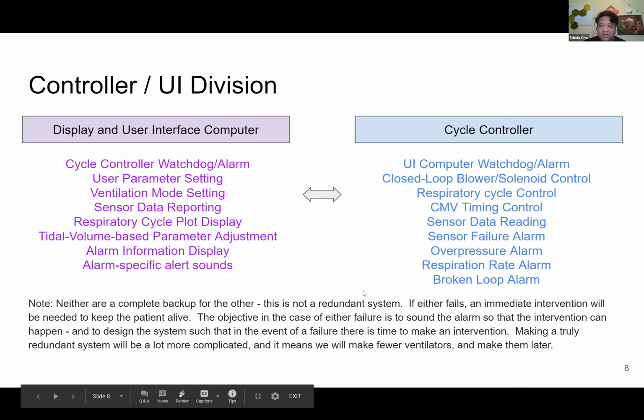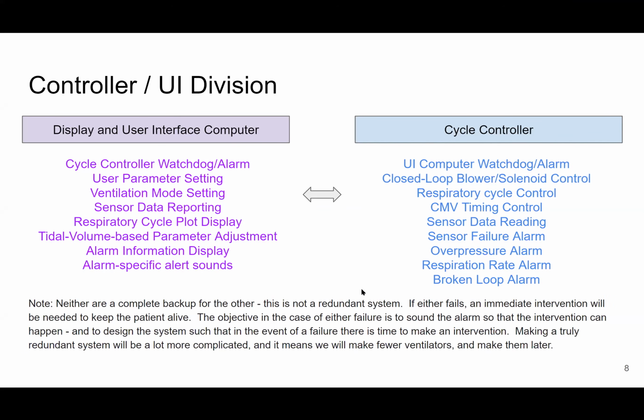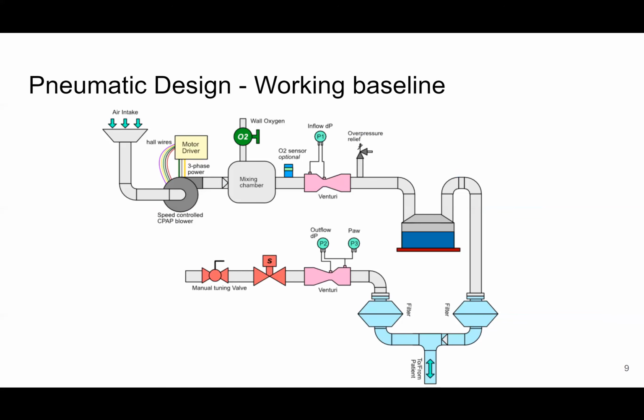Most medical ventilators in use in hospitals do not have full fault tolerance redundancy. I have a question about Derek Yerger here. For the controller, is it not possible to have it still do the activities of controlling the electronics and doing some sensing? If there were a failure in the Raspberry Pi, the data collection and reporting back to the user would be gone, but it would still be able to serve at a capacity of making sure the patient is being ventilated.